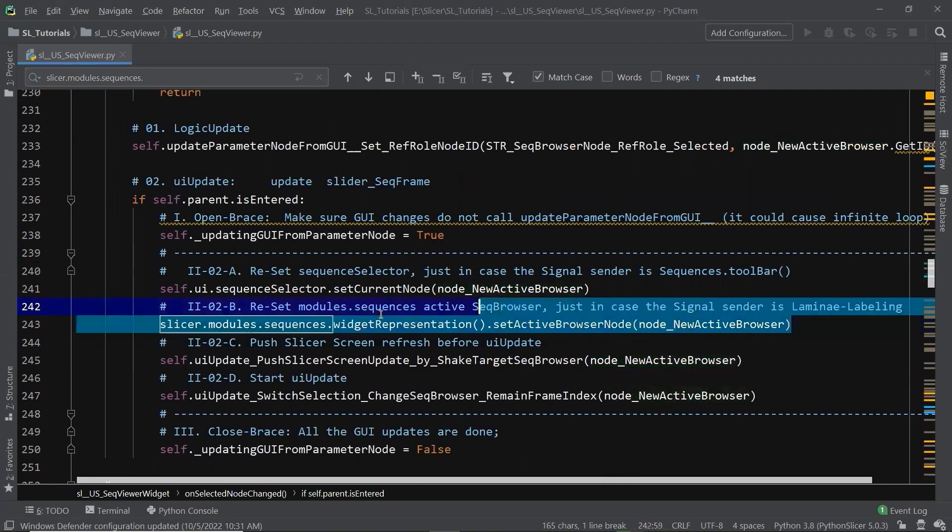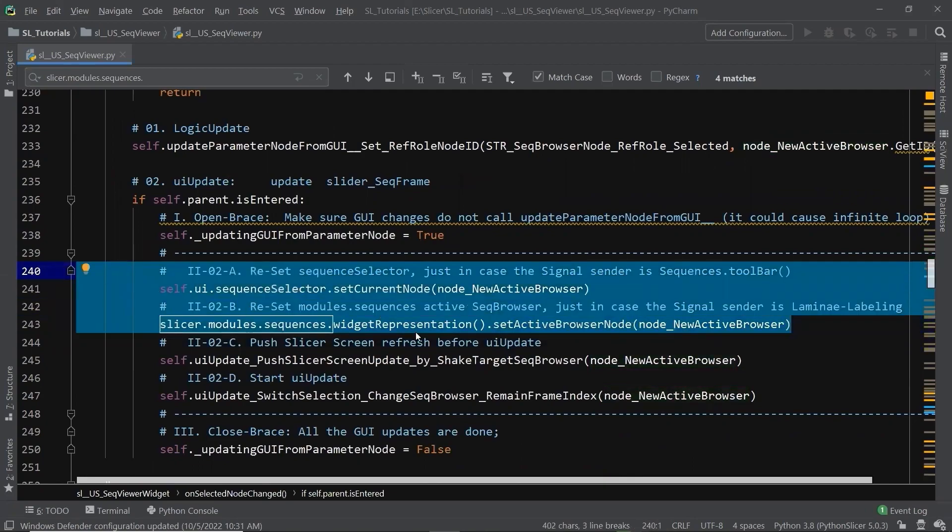because after the second time update, there's not any change in the active Sequence Browser node, thus no infinite loops. In the meanwhile, the two Sequence Viewers can be synchronized at a low cost. Let's go back to 3D slicer, and restart.